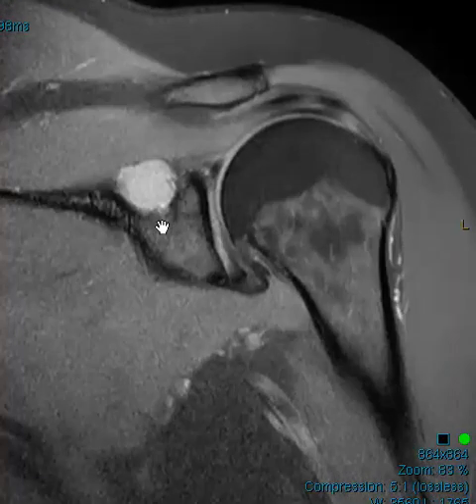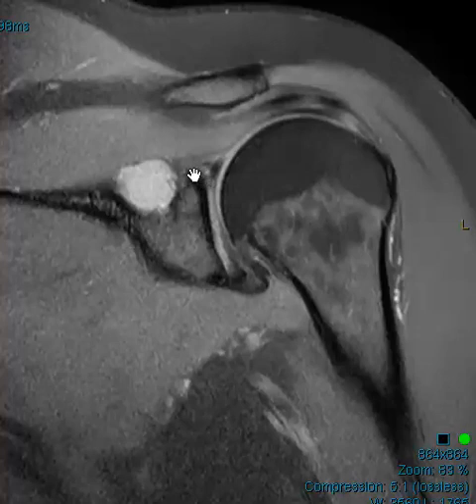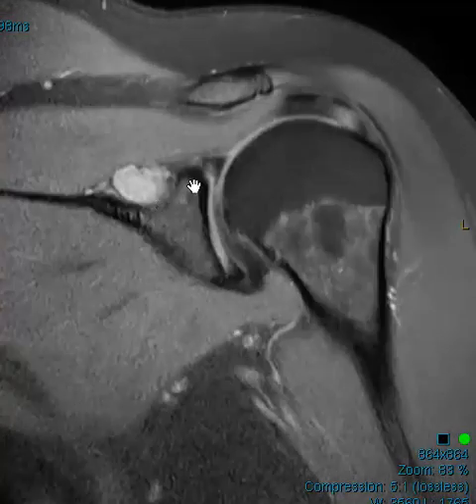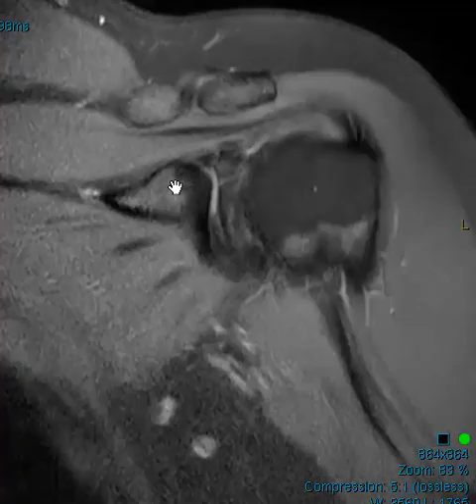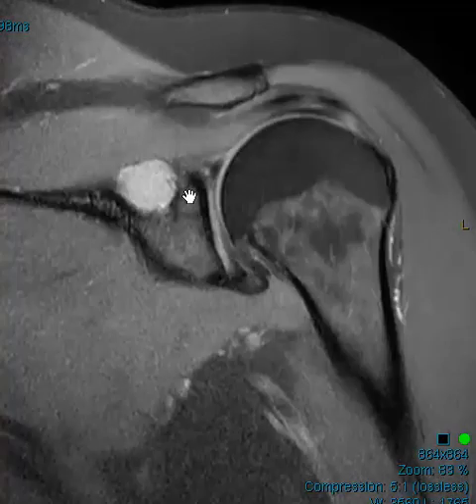Since this is a lobulated fluid collection, the two main things we think of in the spinoglenoid notch are: number one, a paralabral cyst — usually they come off the superior labrum or posterior superior labrum, and typically you see a well-defined tear with fluid communicating into it. In this case, we don't see a really well-defined tear. Going to the superior labrum — here's the 12 o'clock position — I see bright signal, probably interposition of hyaline cartilage, though it could be a small tear.